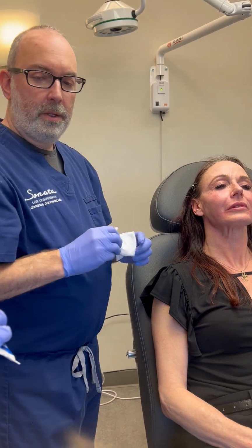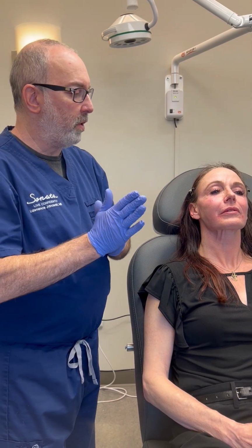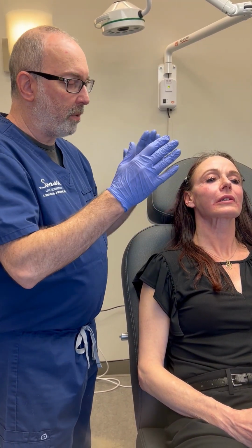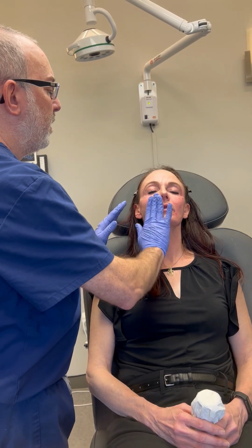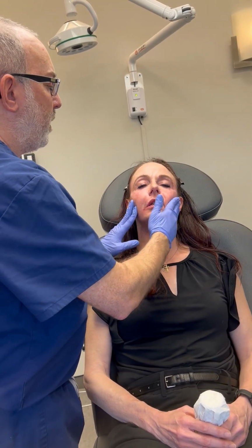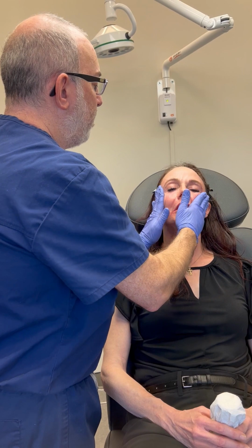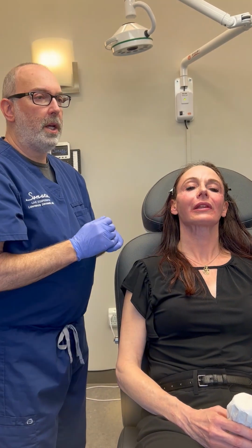Okay, so there's the treatment with a combination of hyaluronic acid fillers and Sculptra in one treatment. And the Sculptra, of course, the effects of that are temporary because it's mostly just the fluid, and that will go down. And then the real effect will come weeks to months later, and the hyaluronic acid fillers, of course, are instant, and they will settle down. So remind the patient to massage the Sculptra areas after treatment, just to get a good distribution there. Okay, and that's it. Thanks a lot.